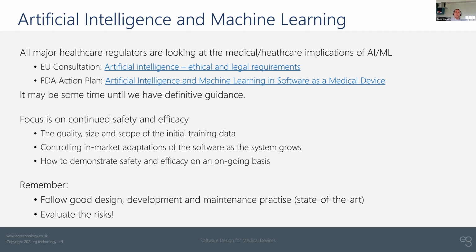But without definitive guidance to fall back on, you really just need to remember that the important point is to follow good design, development, and maintenance practice. And by following 62304, you are following what is still currently state of the art for medical device development.